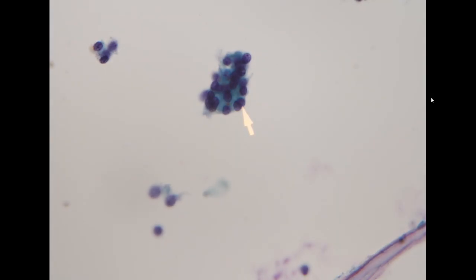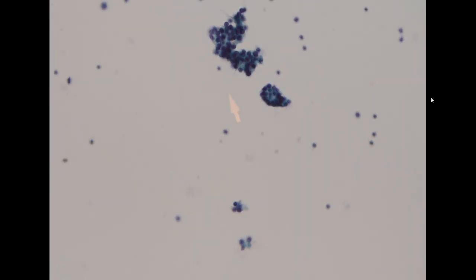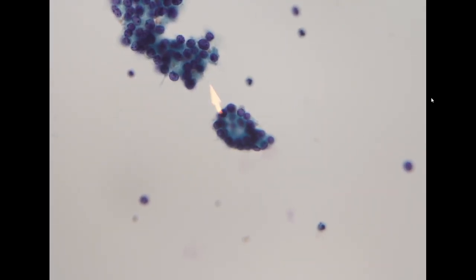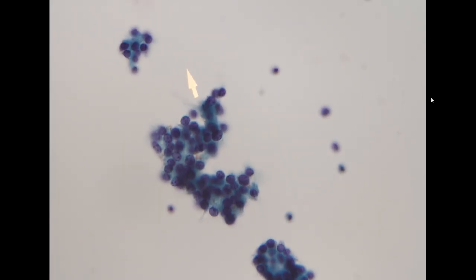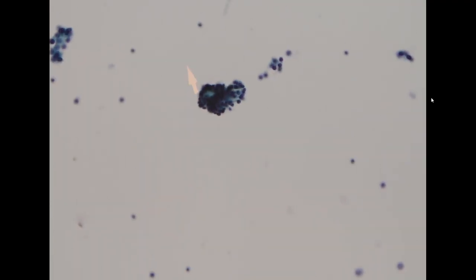So we have an aspirate with mostly microfollicles of slightly enlarged follicular cells, and the background has very scant colloid. So the specimen is compatible with TBS 4, suspicious for follicular neoplasm.